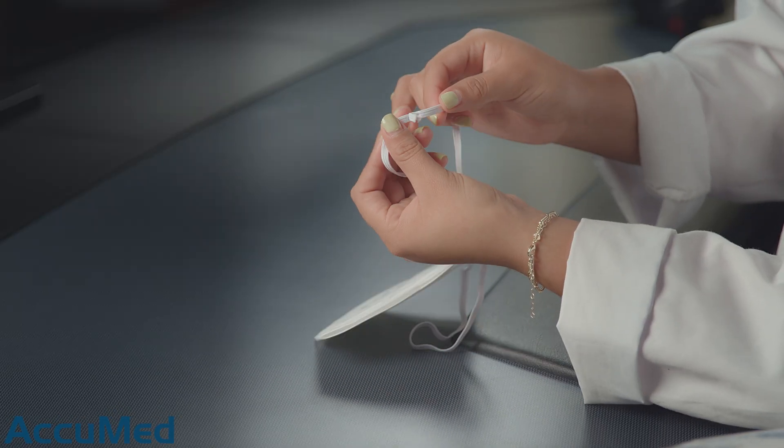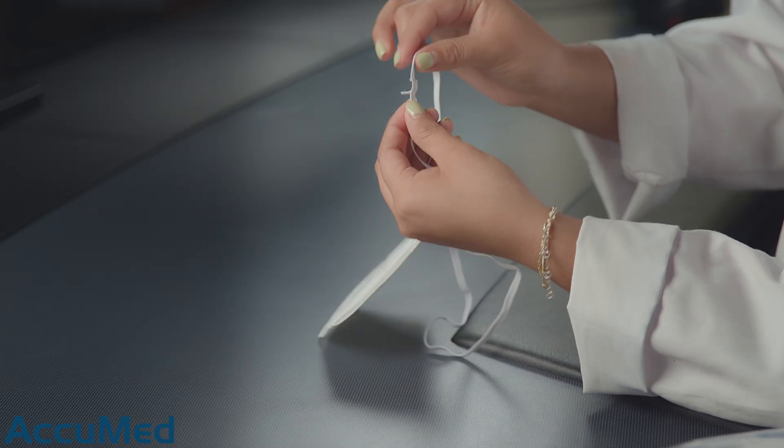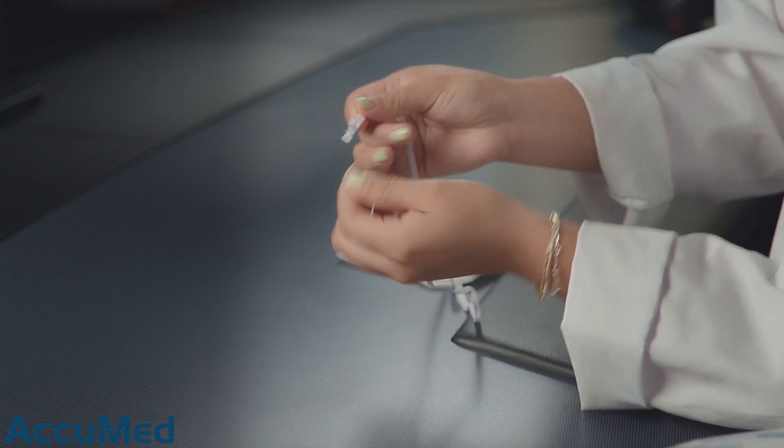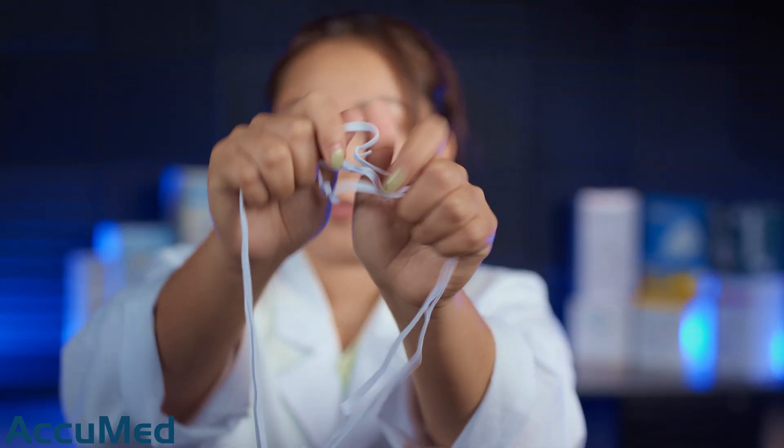The way this headband is being bonded — as you can see right here — the band is just overlapping, and it's extremely easy for these to just rip off. They all have that sort of bonding on them, making it very easy for them to come loose.